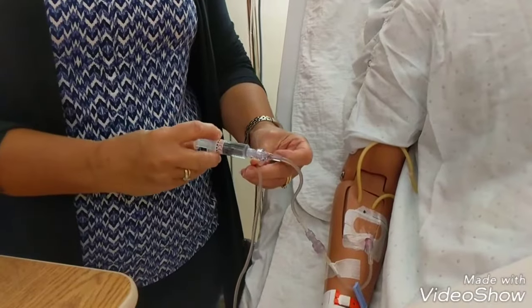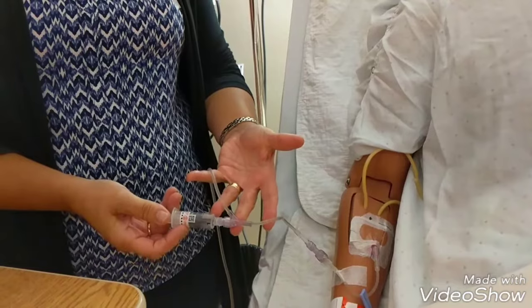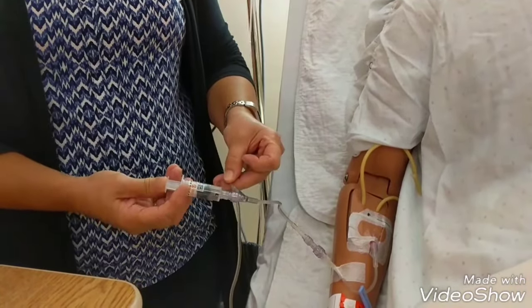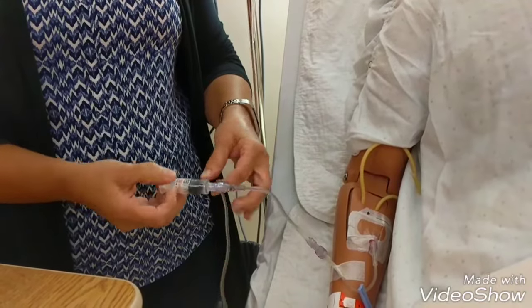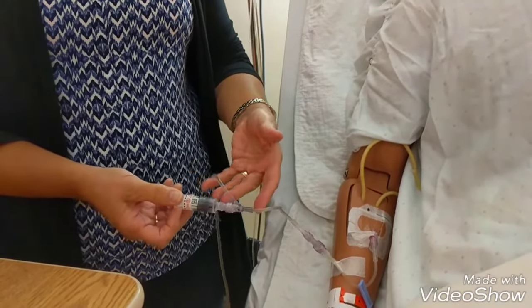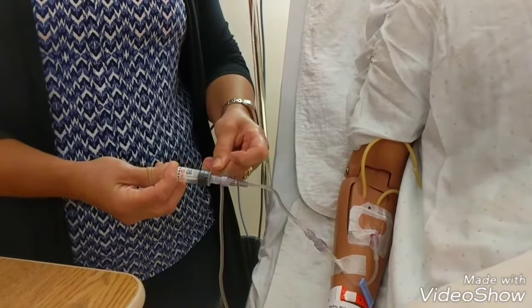I'm going to infuse the flush at the same rate I did my medication, which is 0.1 of a mil every minute. I'll pinch the tubing, instill one mil, unclamp my tubing, leave it open for a minute. Then I'm going to clamp my tubing again, run my IV for a minute, and then one more time clamp my tubing and instill my medication.